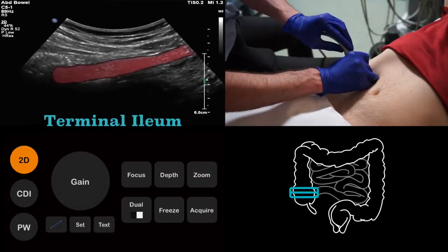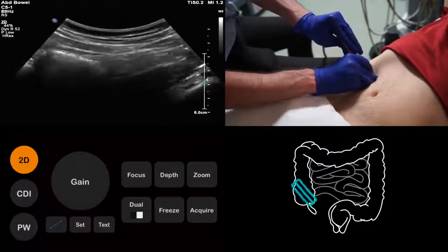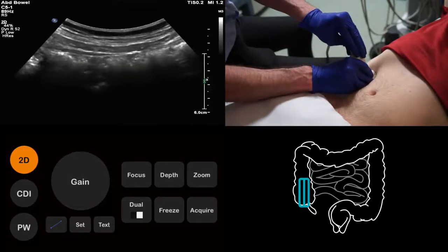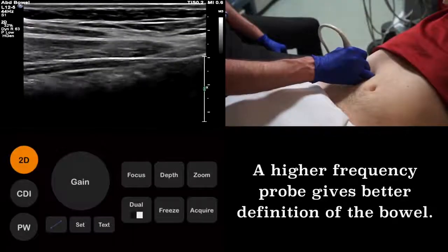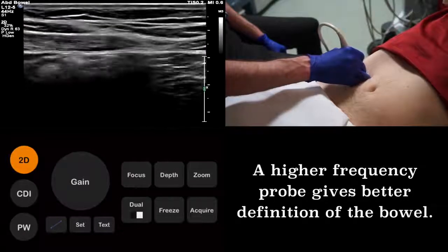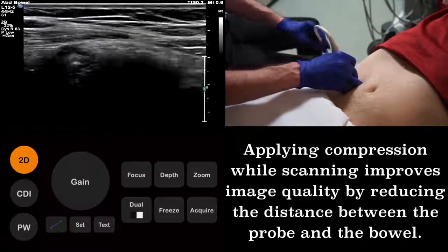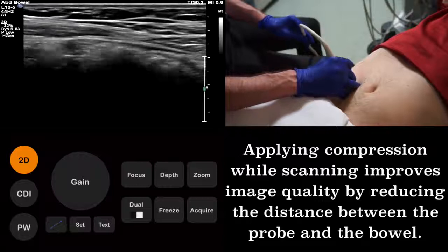We first identify the terminal ileum in its long axis, and then we turn the probe 90 degrees to image it in its axial plane. We will now change to a higher frequency probe. This will give us better definition of the abdominal structures. You can further optimise your image by applying downward pressure with the probe while scanning. This compresses the intervening soft tissue and improves your image quality.